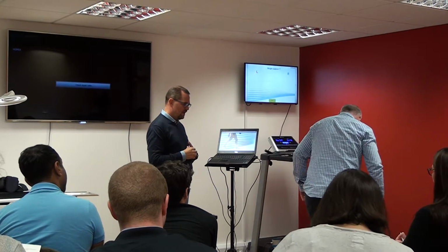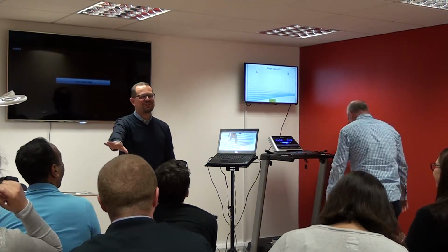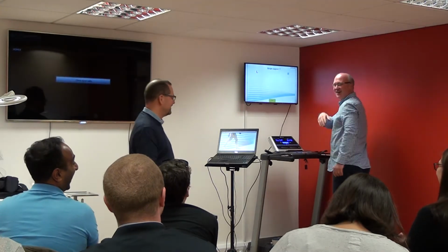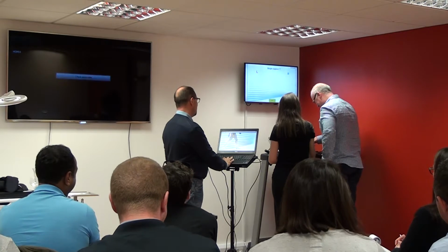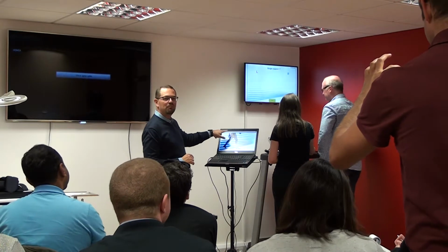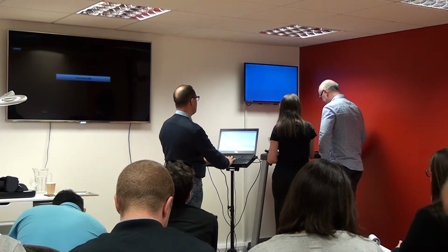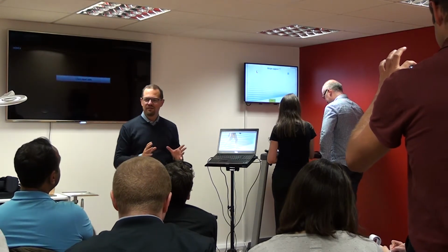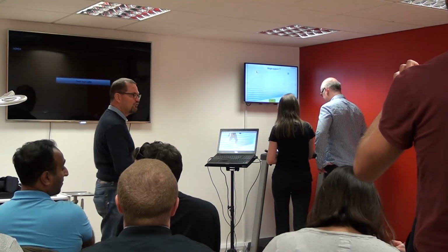I want to show you on the software. Let's say on the software we also have a section that we call biofeedback. If you click on the biofeedback, you have treadmill walking. This is not a test, that means we're not saving the data. It's just an open training session.